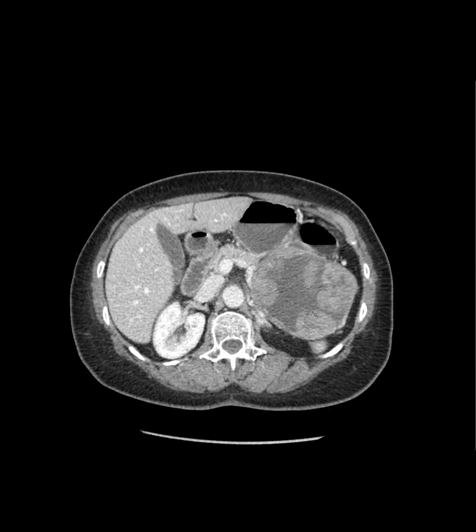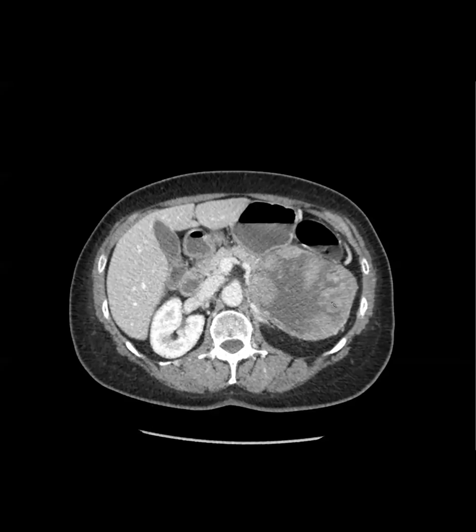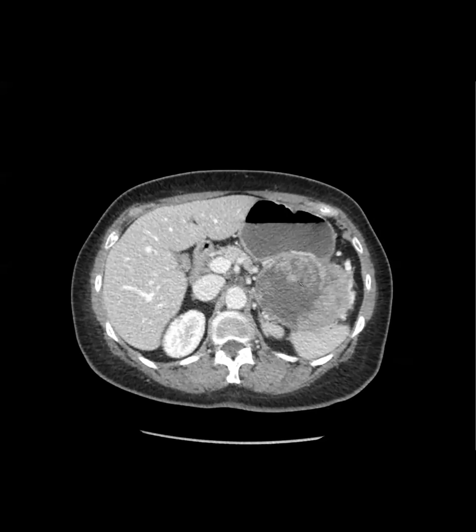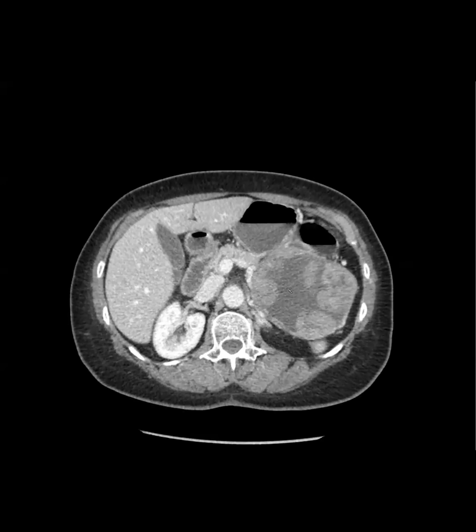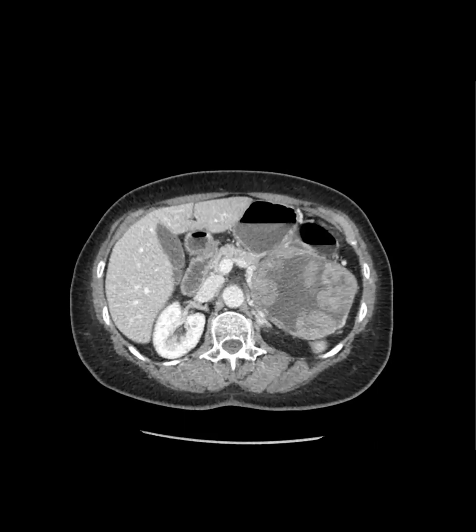But there was a series I read in I think it was AJR. It was from the AFIP, and they had like 102 cases or whatever, and they said their conclusions were that the average size was 10 centimeters. They tend to be heterogeneous. They tend to have central necrosis, and they tend to be well circumscribed, ovoid or round, and 50% will calcify. So I don't know, but I think the last case I showed you shows that there can be some variation, and it can be more infiltrative.